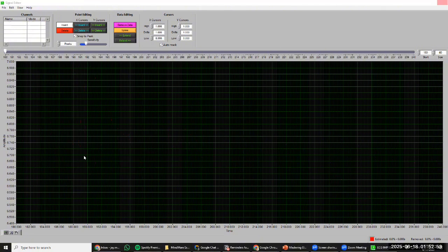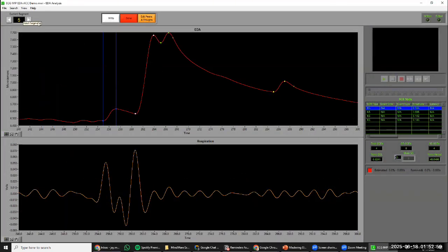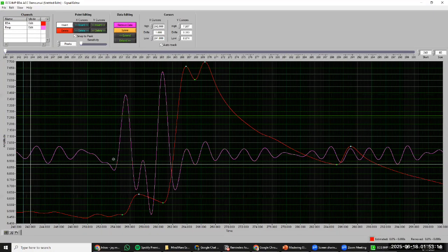So identifying these large respirations and looking at the difference between those two is very helpful. And later on, we can see another example of that. So we have two very large respirations here, at least relative to the other ones. So we would definitely want to focus on this segment a little bit closer, and we can use our X cursor tool function to help walk through this.